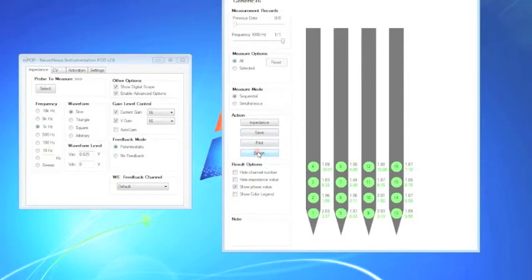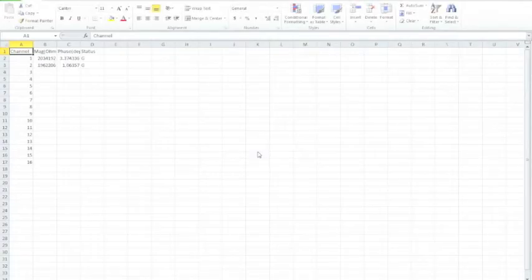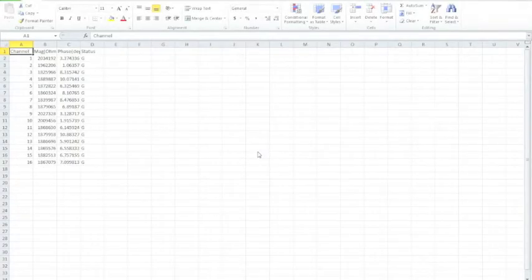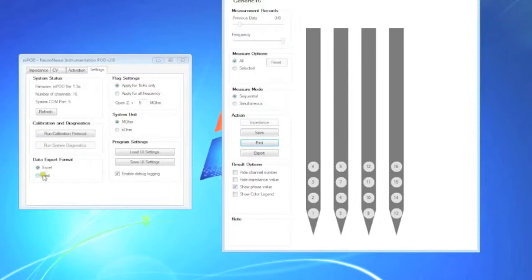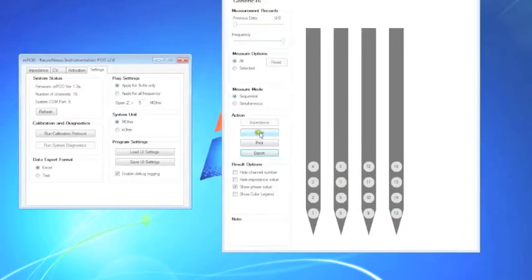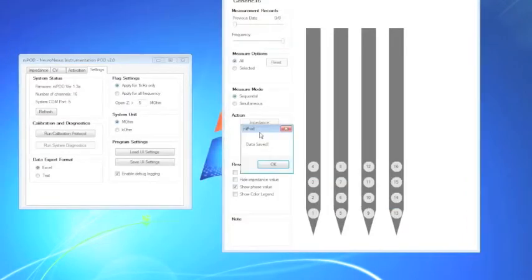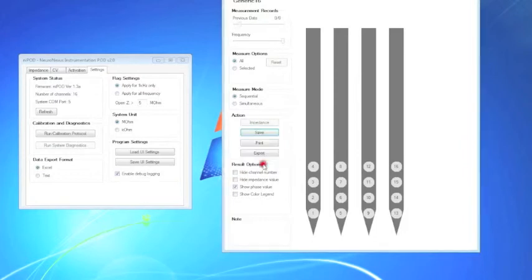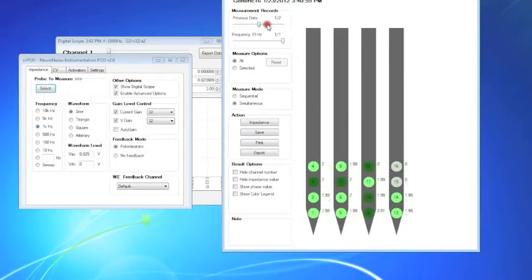You can export it to either an Excel spreadsheet or to a text file, which looks like this. Or you can save the data and view it later by scrolling through the measurement records at the top of the probe visualization interface.